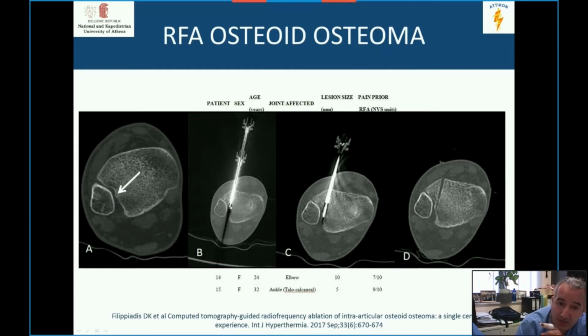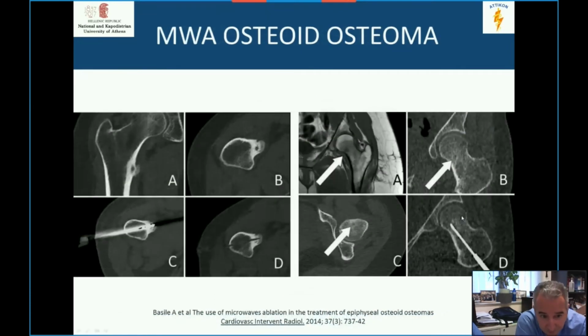We are putting the biopsy needle for sampling, then the radiofrequency electrode. Here is the part where you have your ablation zone, and it will extend posteriorly, preventing, as a prophylactic measure for the cartilage joint. And in the computed tomography, at the end of the ablation, when you have removed everything, you can see the intraosseous route ending exactly inside the nidus.